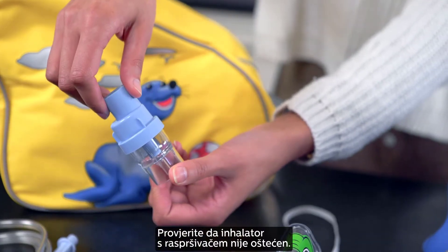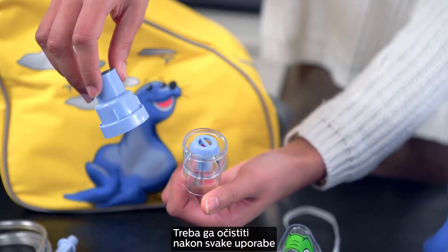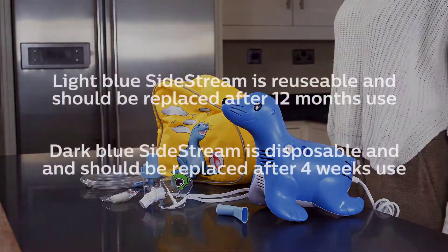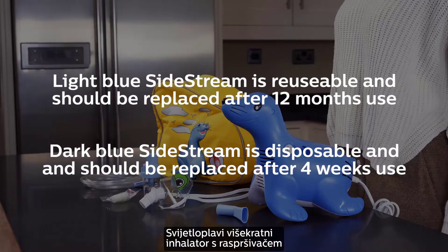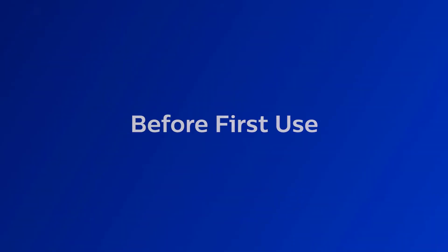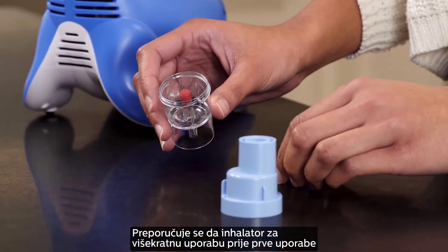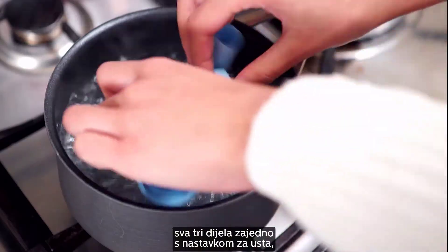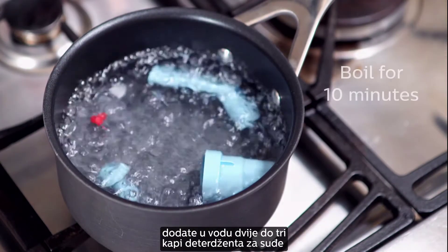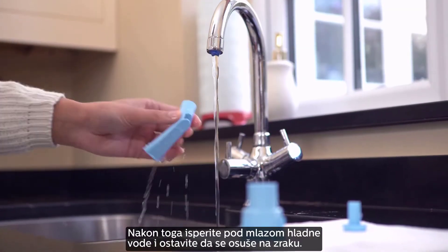Check the Sidestream nebulizer for any damage. The Sidestream nebulizer provided with your Sammy the Seal is reusable. It should be cleaned after every use and replaced according to the instructions for use. Before your first use of the reusable Sidestream nebulizer, you should take it apart and boil the three parts, together with the Sidestream reusable mouthpiece, in water with 2-3 drops of dishwashing liquid for 10 minutes. After boiling, rinse under cold water and leave to air dry.